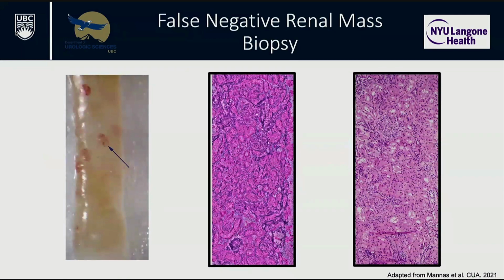And I was thinking more in terms of transplant, because that's where, or benign renal disease. And what I want to do is just look and see, can you see the architecture? And here's an example. Routinely, and not even at all centers, you take a renal biopsy and someone will look under a light microscope and look for glomeruli.